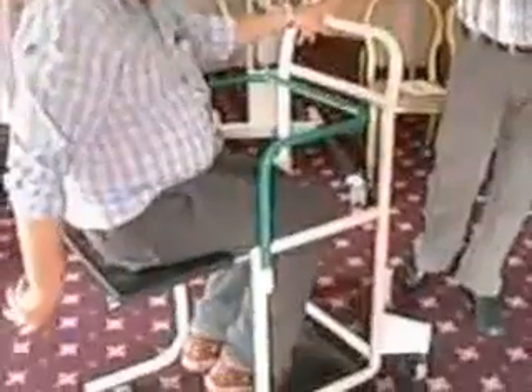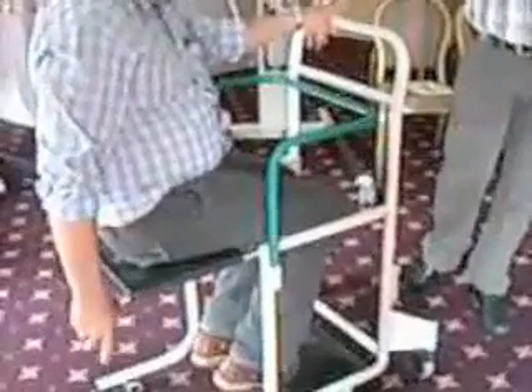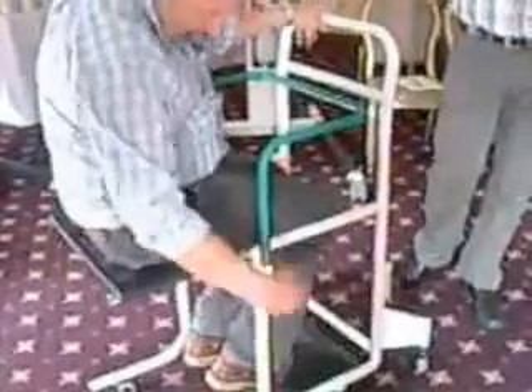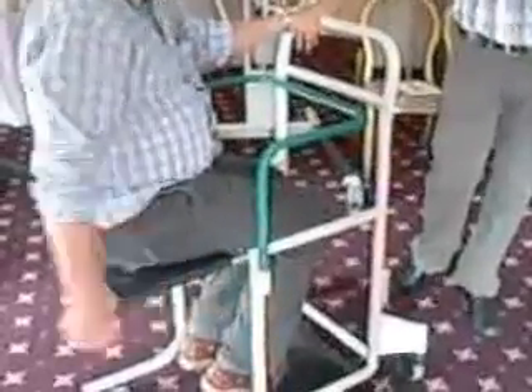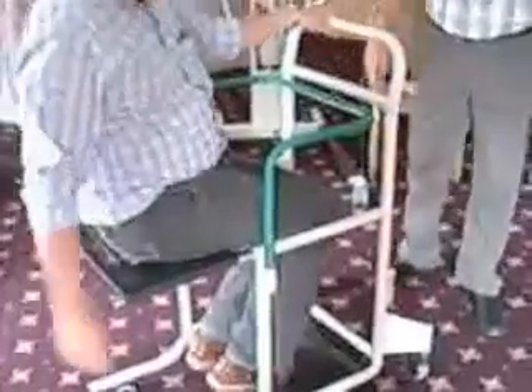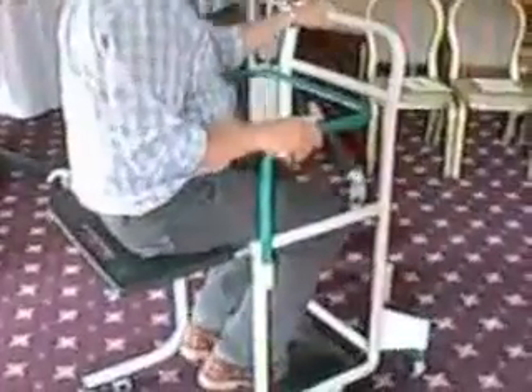Between a chair and a wheelchair — sometimes there is an electrical wheelchair with the batteries in front — we will move the legs to the other side so they go around. Here at the toilet it goes between as well, so you don't need opening legs and you don't need moving parts. It is very easy.